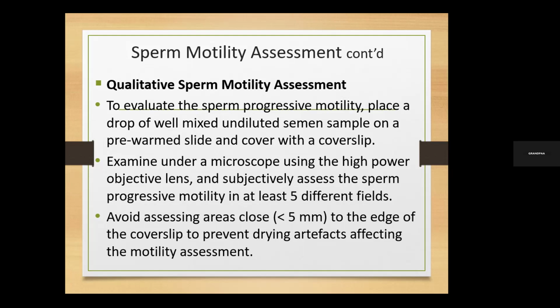What is the reason for not examining immediately after applying the cover slip? Who can tell me? When you are doing your motility assessment, it is advised that once you put on your cover slip, you allow the slide to lie down for about a minute before you examine.